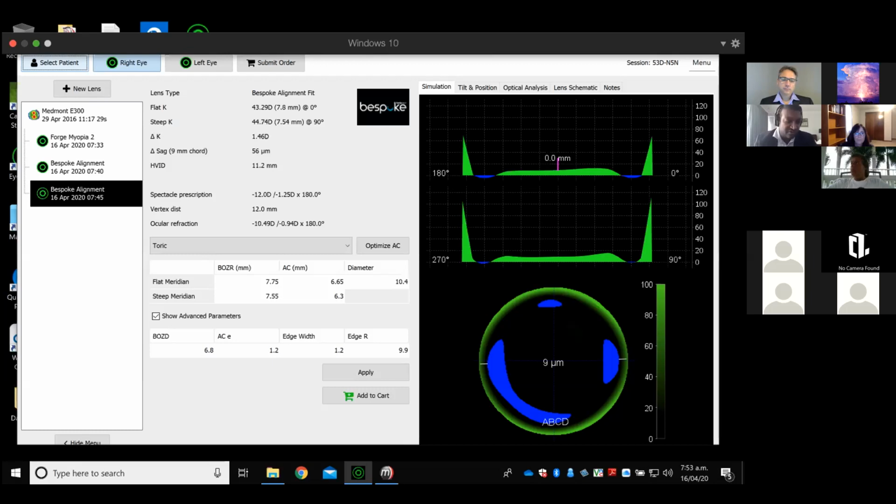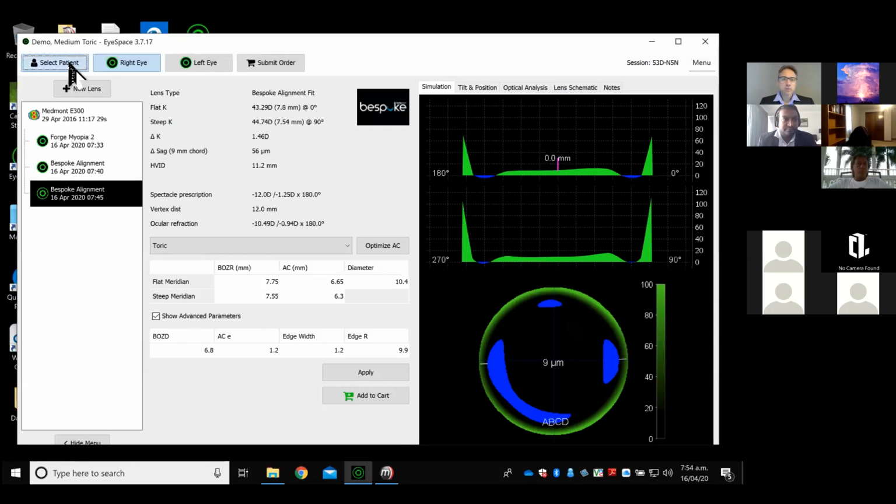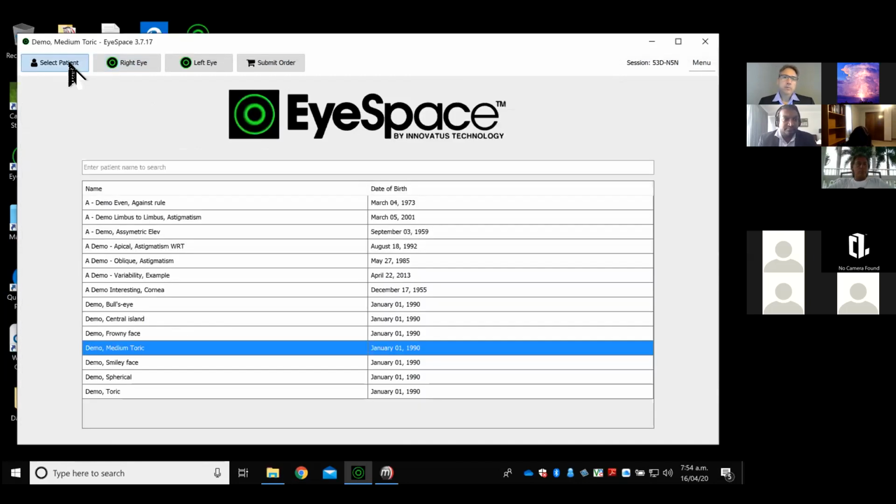But who would you normally be fitting this with, in a textbook case, the best cases? I think you've touched on that. It's a normal day wear lens, meaning you can fit anybody with a normal cornea, but we find people will use this quite often when they're dealing with high prescriptions or high astigmatism and slightly irregular corneas as well.